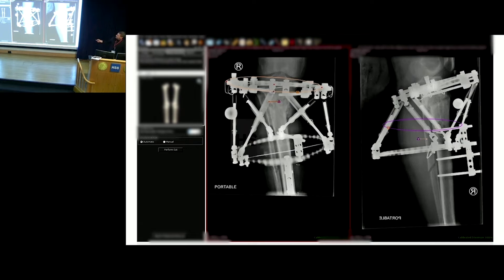These are the post-op x-rays of that patient taken in the OR — either in the OR or a couple of minutes later, or whenever you want to do it in your clinic office. I'm using the software to generate the deformity parameters, and in this case, with this specific hexapod, the mounting parameters to then plug into the web-based software for this particular hexapod.